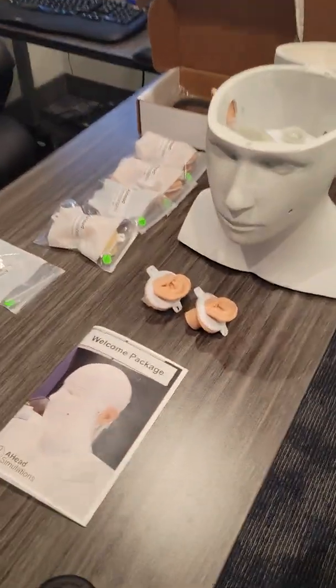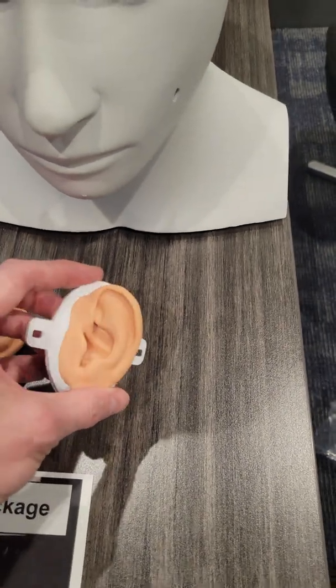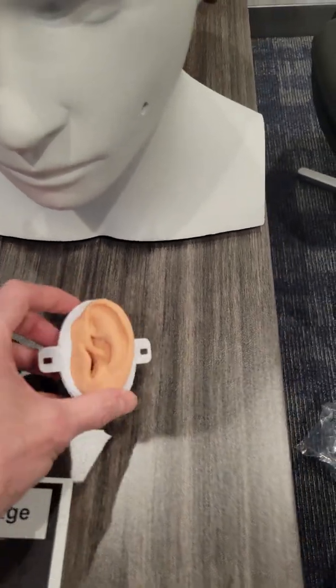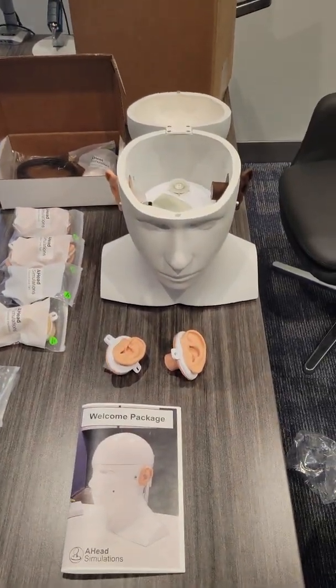You can also see that there are a bunch of different types of ears that they send along, with different types of ear canals for ear wax removal and training and all of that. So super excited to introduce you guys to Carl!